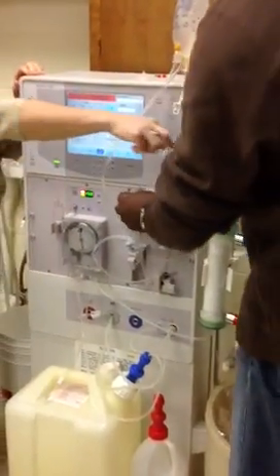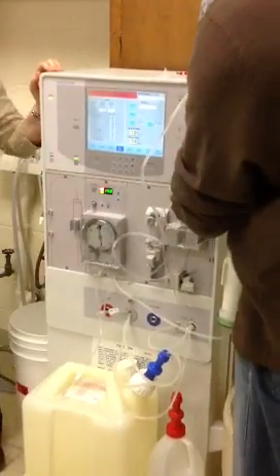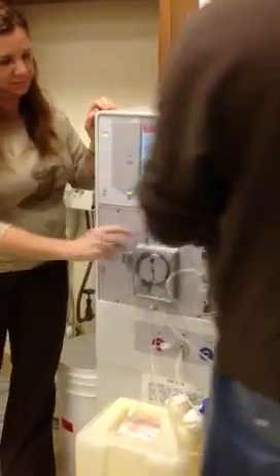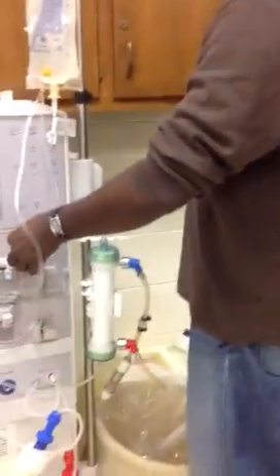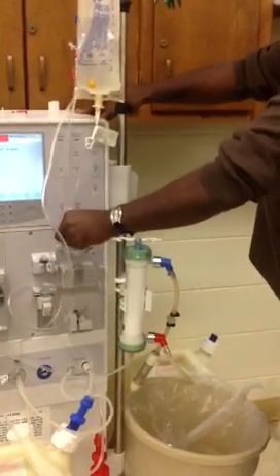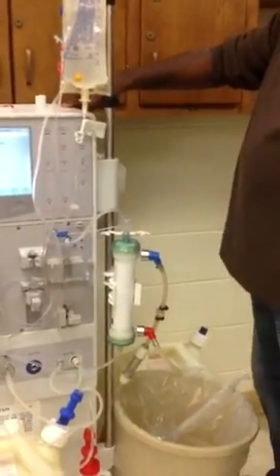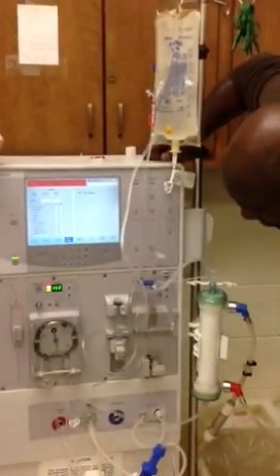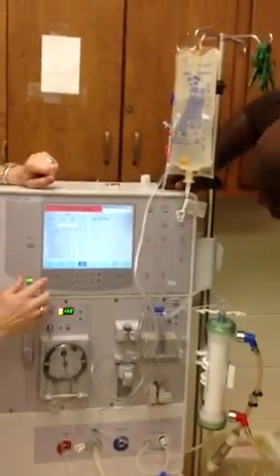Then you're going to put on your venous pressure line, which is at that pod. Unclamp your venous pressure line after that's connected. And then our recirculation button will be... it's going to be test. Hold on — pause. It's actually drifting now.